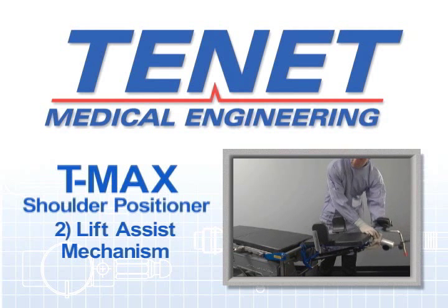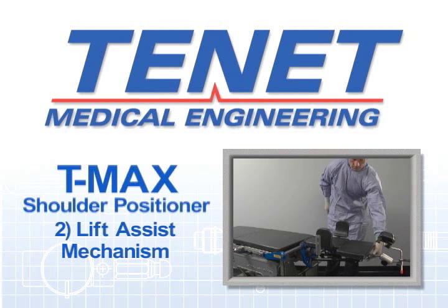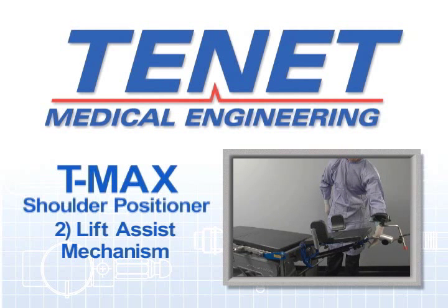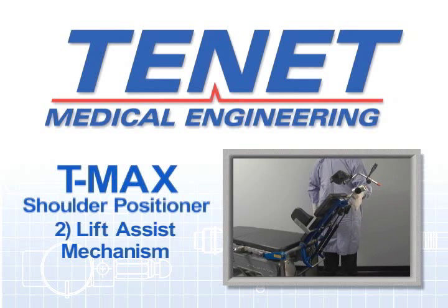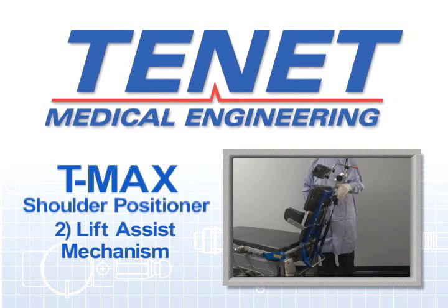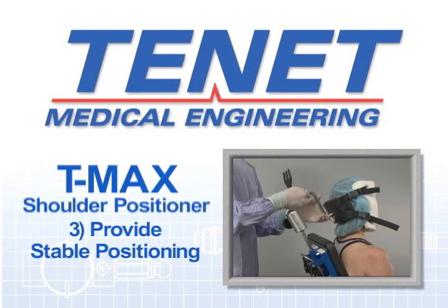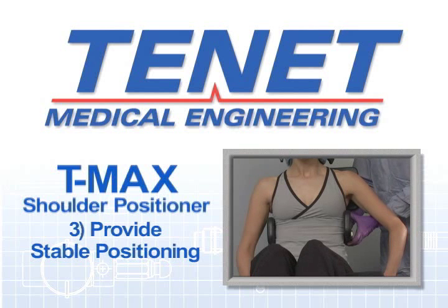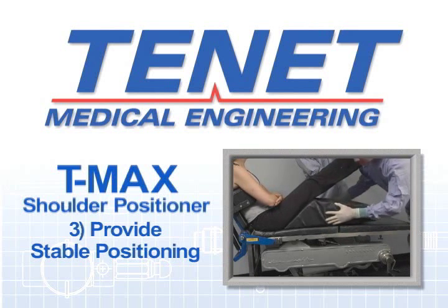Second, creating a lift assist mechanism. For larger patients, most beach chairs that are not integral to the OR table require the staff to lift the patient to the sitting position, which is a very difficult task with larger patients. Third, providing stable positioning so that the patient remains in the same position throughout the surgical case. This is a very important requirement for anaesthesia.